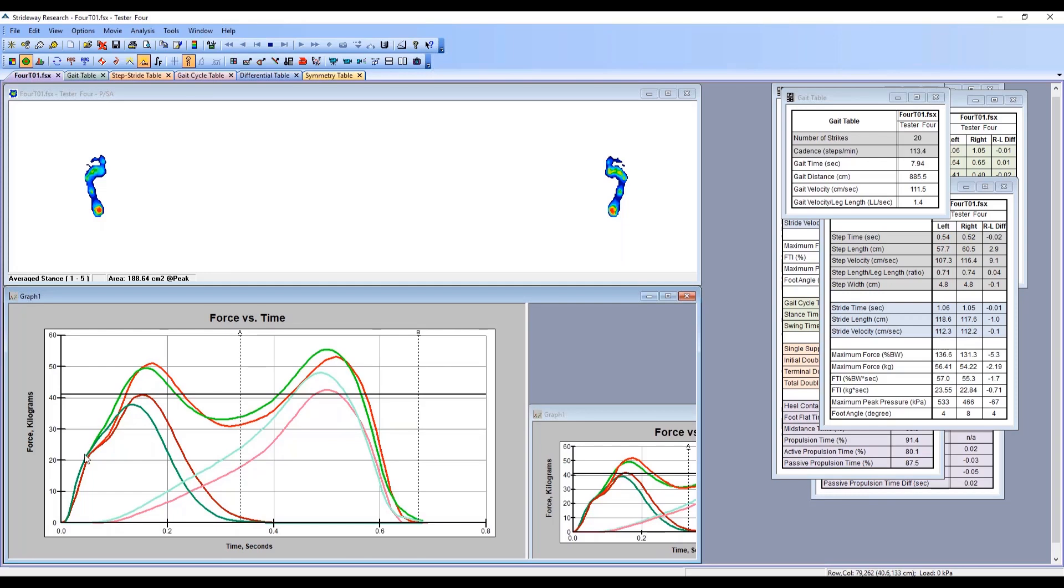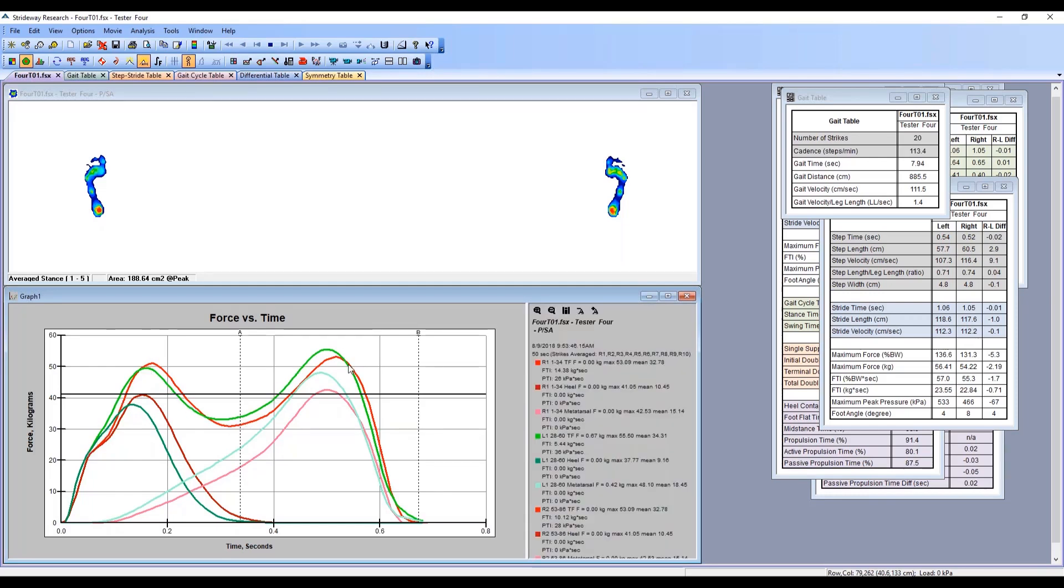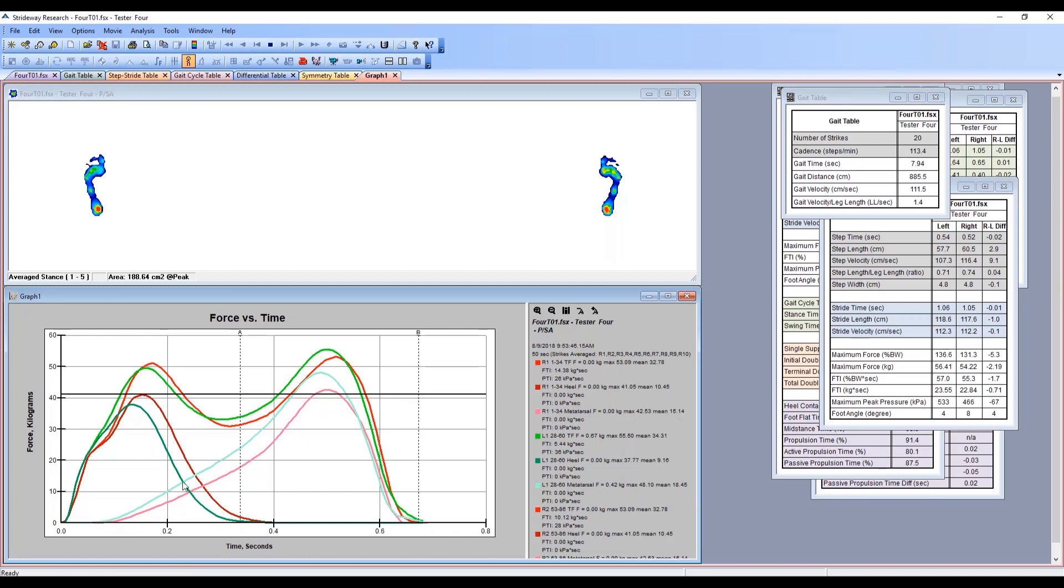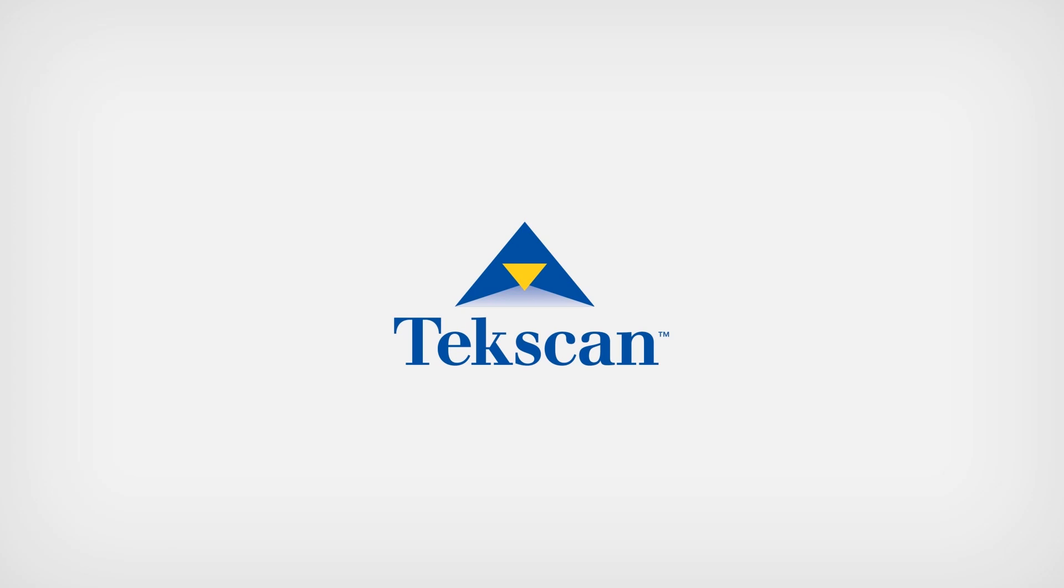You can see our light green is associated with our left foot total curve, the red is the total curve for the right foot. Then we've got a different shade of green which is our left heel curve from the box that was boxing out the heel. The dark red allows you to compare the right and left foot directly for the heel pivot component of the stance phase. On this side, the blue curve is our left forefoot curve, and the pink or fuchsia is our right foot. We can look at the differences much more in depth in terms of how much asymmetry there is between the left and right foot curves.